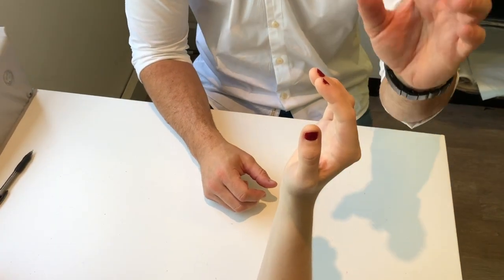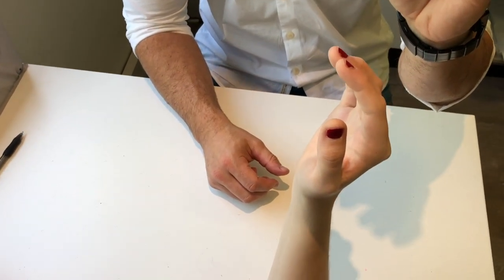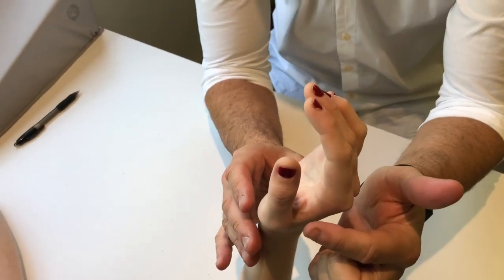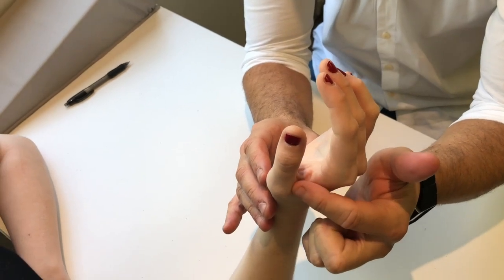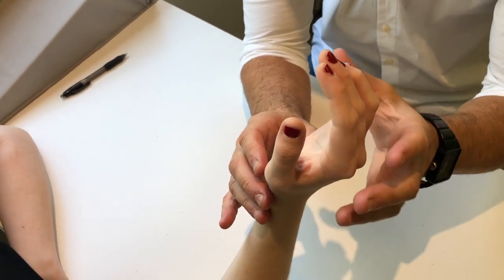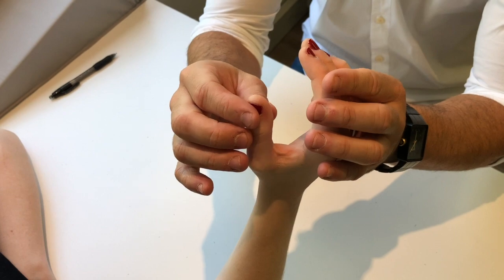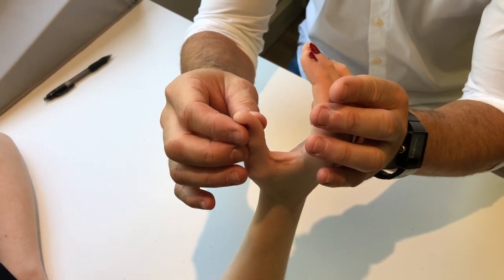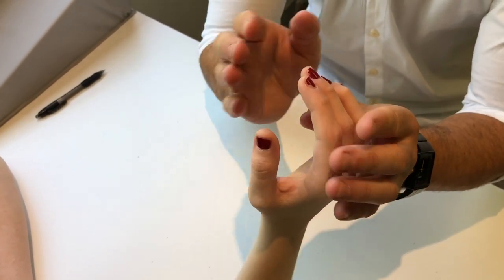We want the person to be able to oppose in the splint if they want to. If you had an ulnar collateral ligament injury, you wouldn't want that because you don't want your patient pinching. You'd position their thumb out here somewhere. But for this one we want our thumb in a functional position.